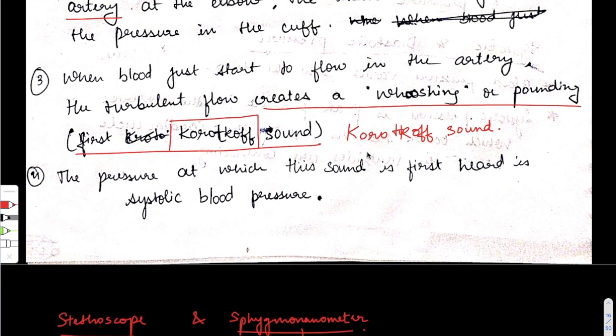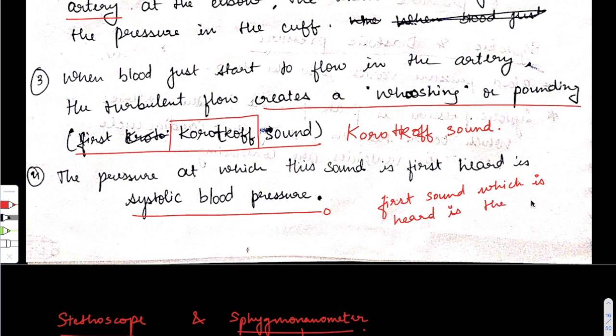The pressure at which this sound is first heard is the systolic blood pressure.